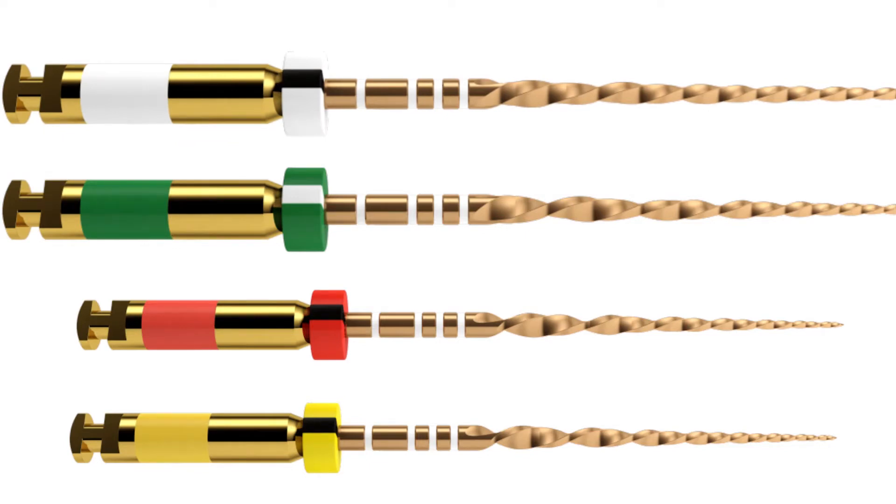In some cases, you will find that an apex is larger than 25. In some other cases, the canal itself is very large. The WaveOne Gold family allows you to address each of these different situations.